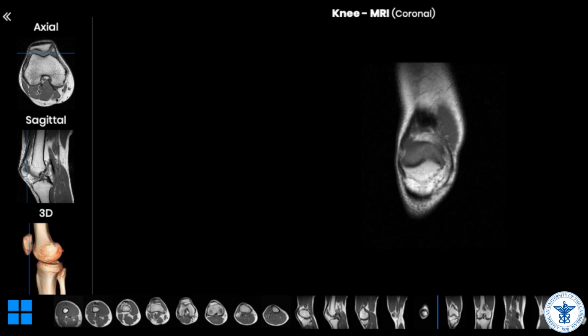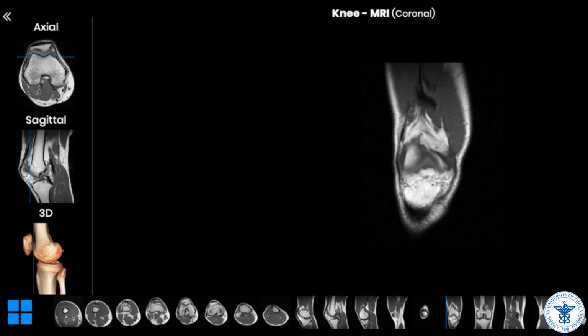You know, if we have any infection here, arthritis, the suprapatellar bursa is the one which will accumulate the excessive fluid and appear extensively bright on the images. You see some muscles around. This is our vastus medialis on my right and vastus lateralis on my left. The darkish area between them is the tendon of quadriceps femoris.